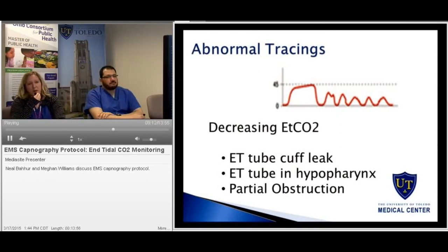You also have to think about a partial obstruction of the tube. Nothing that's causing a complete obstruction, so there still is some CO2 coming through, just not as much as you would expect for normal values.